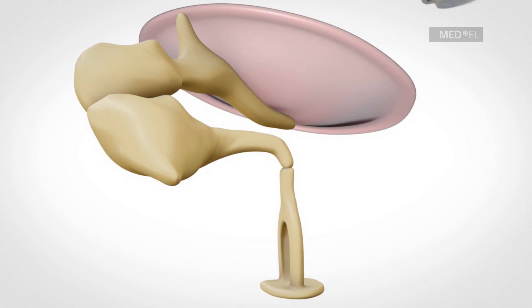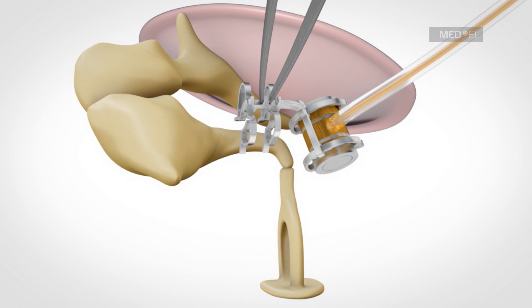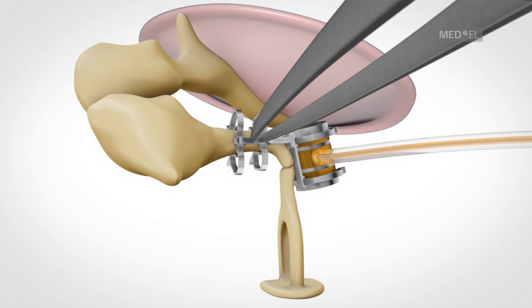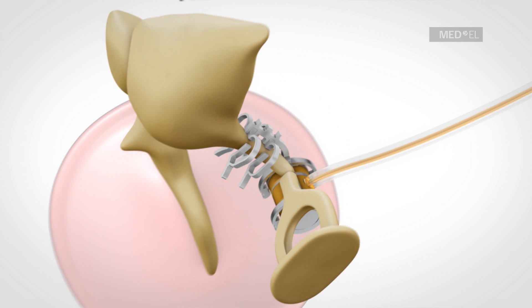The INCUS LP coupler is attached to the long process of the INCUS. It has an improved coupling and an easier handling without the need for crimping.